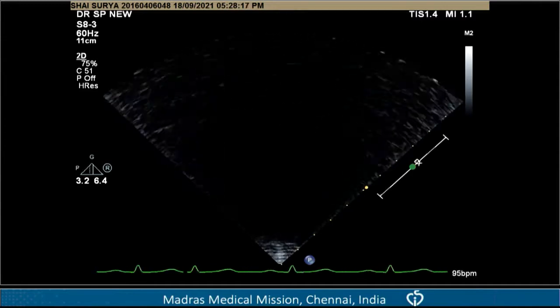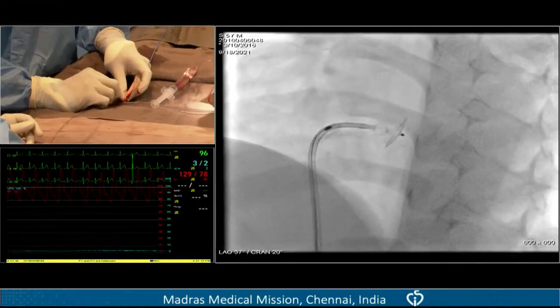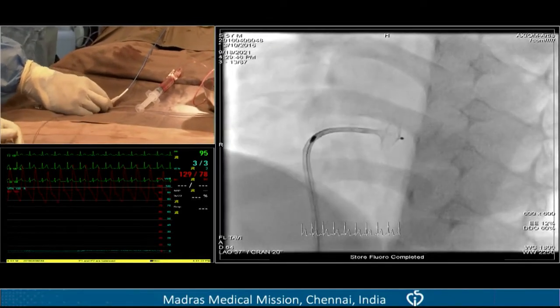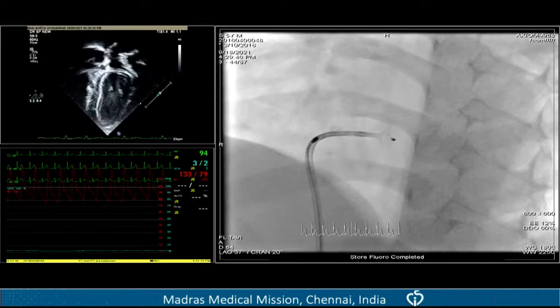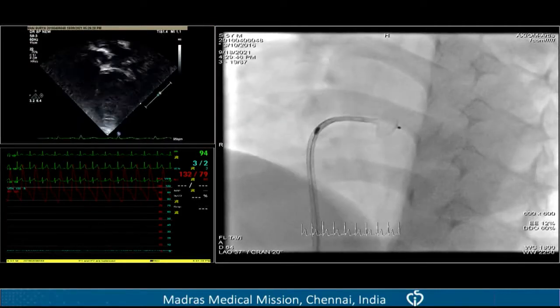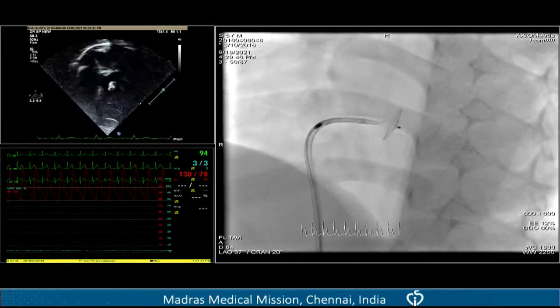Just be conscious of the appearance of the mitral valve leaflets. Yeah, mitral valve I have come out, Neil. Okay, sure. Now show the, I have come out into the LVOT now. Show the device. You've opened both the discs in the LV. Two discs, right? The central belly also in the LV.